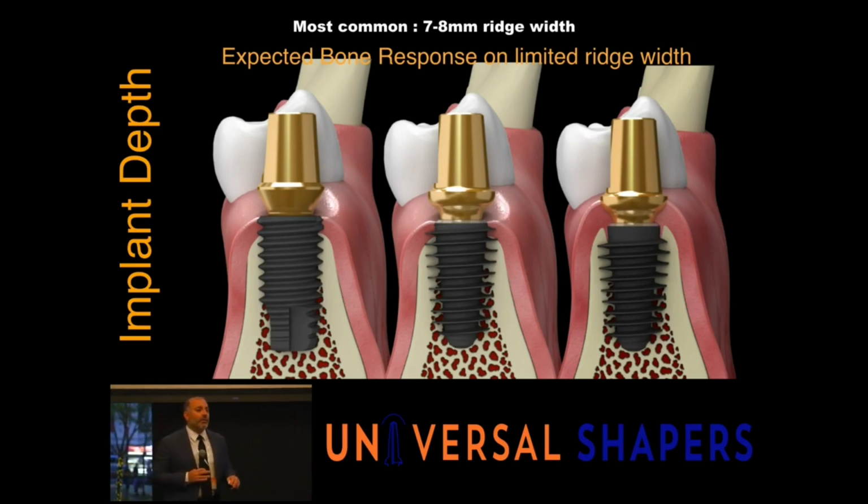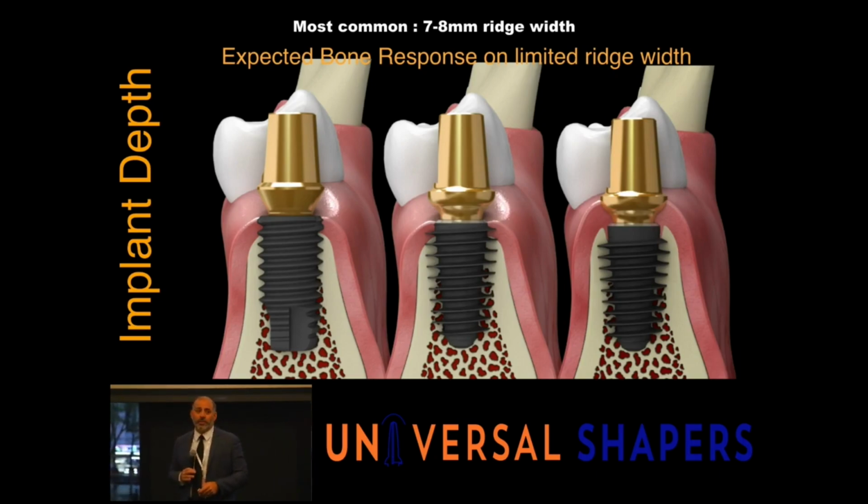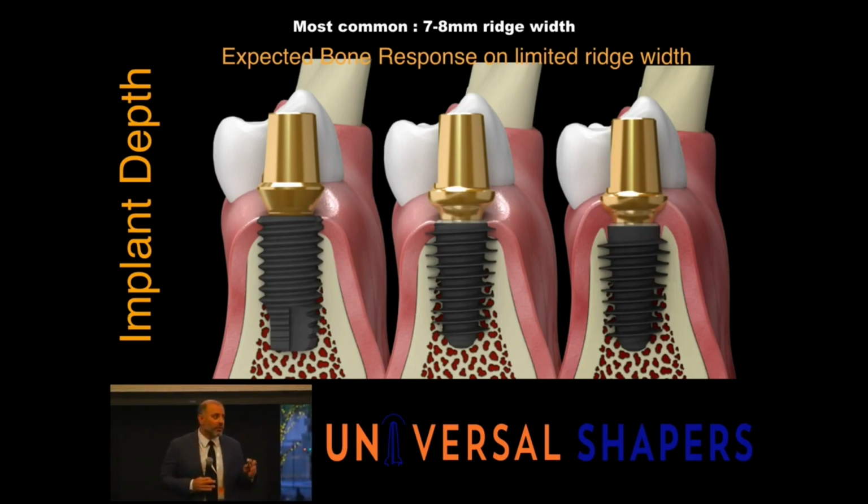I am not including tissue level implants here. That is out the window for this conversation. Tissue level implants is a whole different ball game. And they work great. They work great for the posterior. Sometimes in the anterior we try to avoid those because it's very difficult if we need to do something later on, a revision surgery basically, to recover. So bone level is nice because we can keep switching out the platform and not have to worry about where that margin of tissue level is. But tissue level implants, different breed. So we're strictly talking about bone level implants for this.